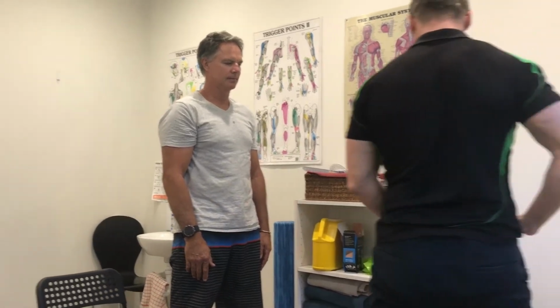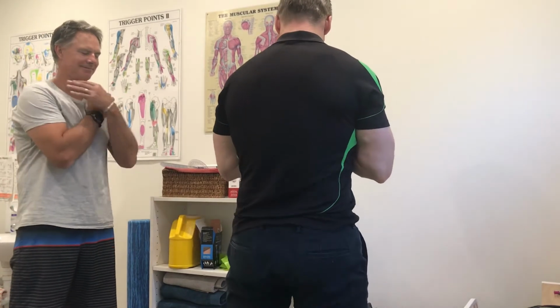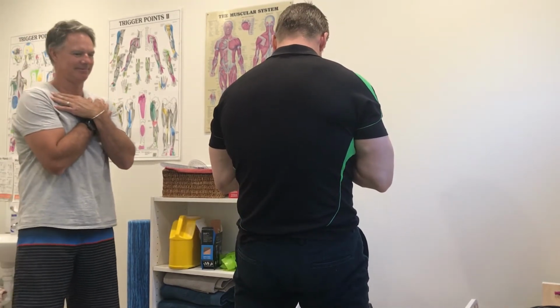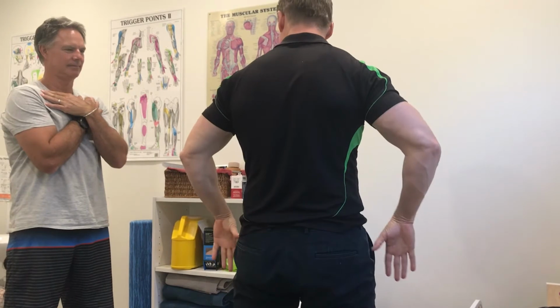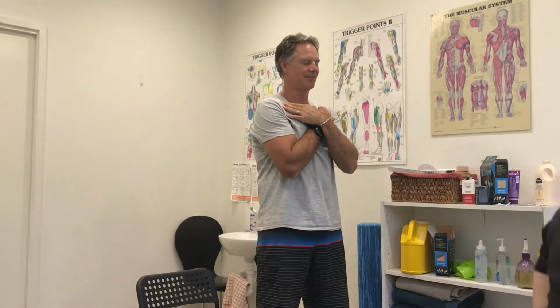And this next one is the pelvis, trying to dissociate that from the back. So you're going to keep your body still, stick your bottom out, and then thrust it forward, like a pelvic thrust, and then back into that middle position that you've been in between. So bottom out, bottom forward, middle.